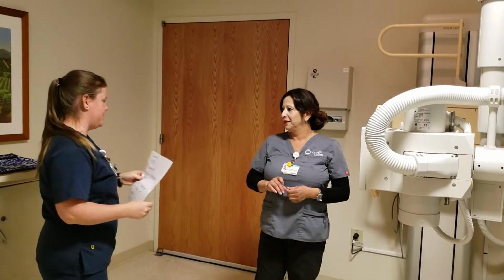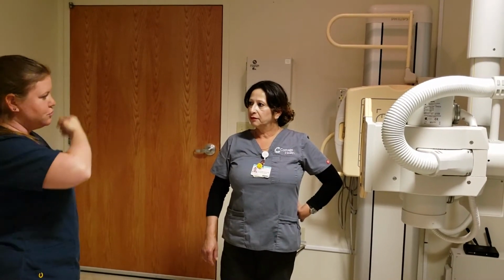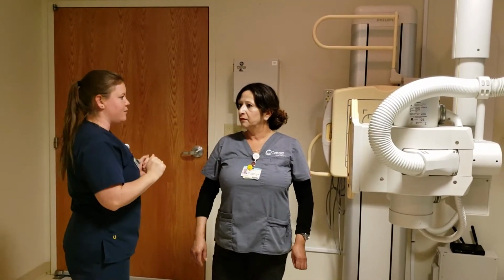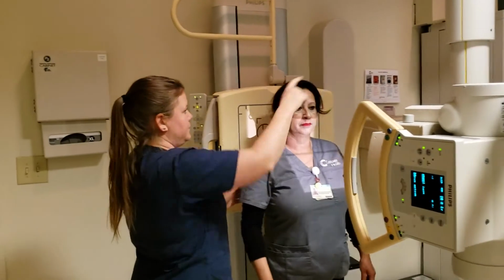Okay, so I'm gonna position you. Well, first, I'm gonna have you remove any metal or jewelry or any metal hairpins. So no metal in there. Alright, you removed your earrings. Everything is good. So I'm going to position you over here. I'm gonna have you come stand over here, facing that wall.